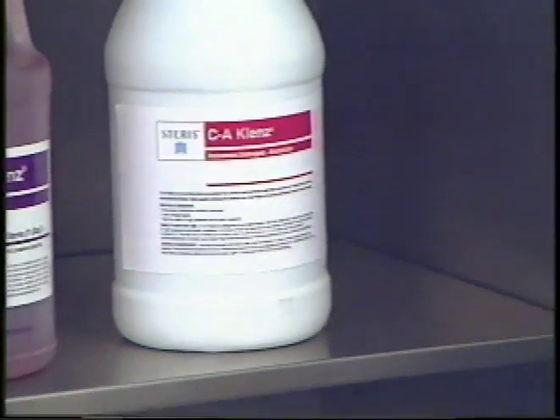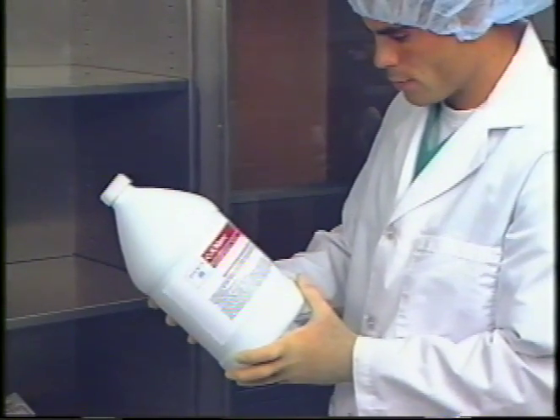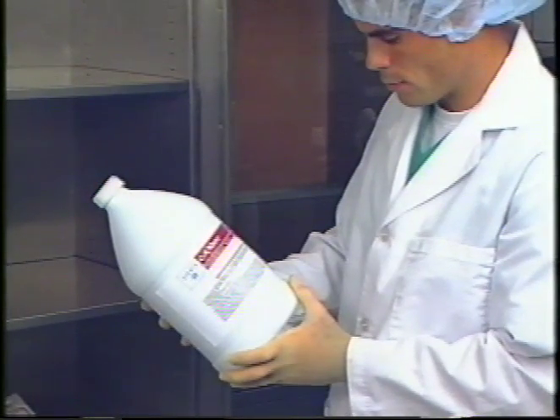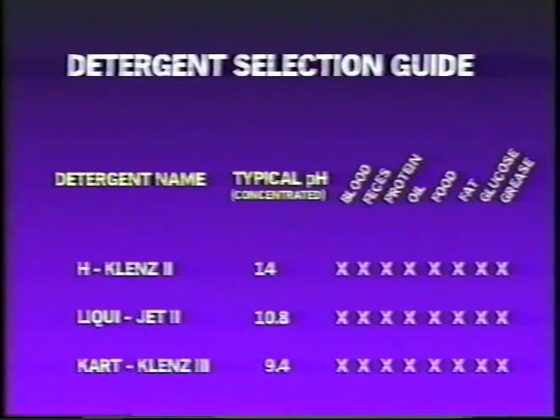The highly alkaline detergents usually contain potassium or sodium hydroxide or a type of caustic soda as the primary active ingredient for dissolving power, to which is added sodium metasilicate as a corrosion inhibitor and water softener. Usually, other agents are added to prevent calcium or magnesium salts from precipitating out when the detergent is used in hard water. A wetting agent or surfactant is also added to increase coverage. As a general rule, the highly alkaline detergents possess rapid dissolving power for proteinaceous and emulsifying fats and oils.